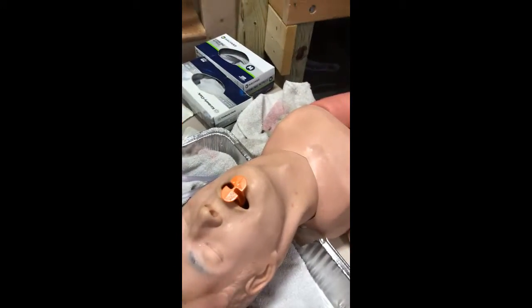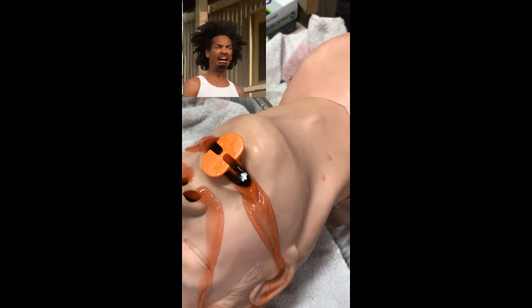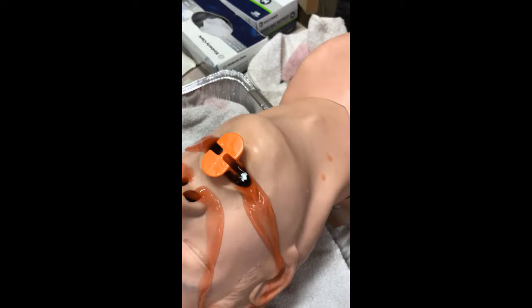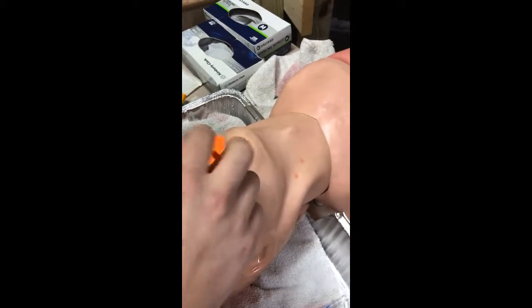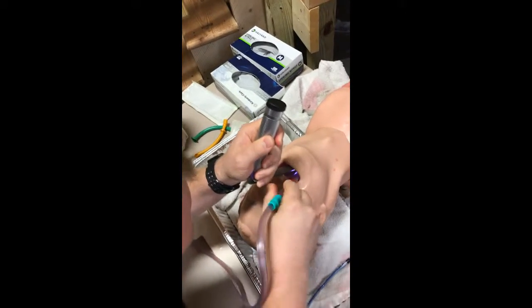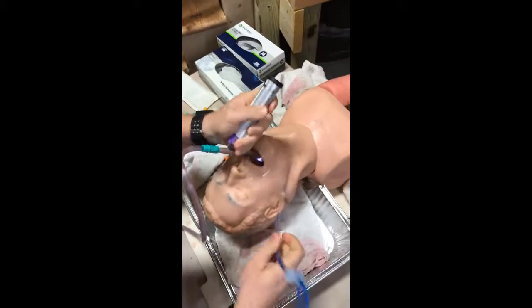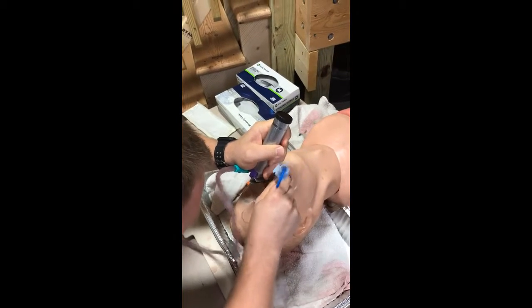The next thing we're going to see is paramedic Rob Daly, who's going to have a similar problem. We've all had this occur — the vomit's coming out of the nose, the mouth, and everything else, and we have to get that airway clear. Rob is, as Dominic did, going to use the SALAD technique and establish a good amount of suction into the airway. Then Rob is actually going to do more of the standard procedure, where he's going to move the suction catheter over to the left side of the mouth and keep it in the esophagus while he visualizes the cords and places his tube.